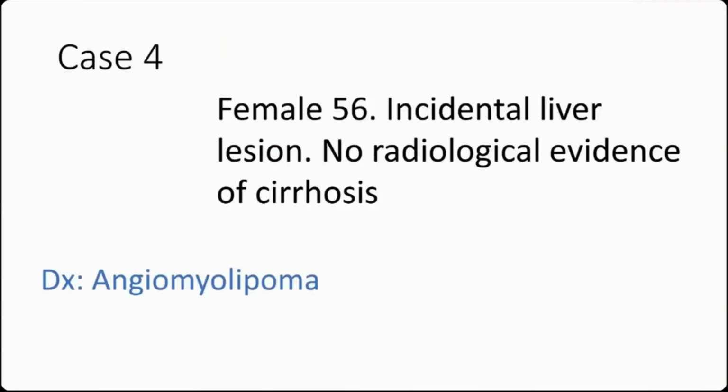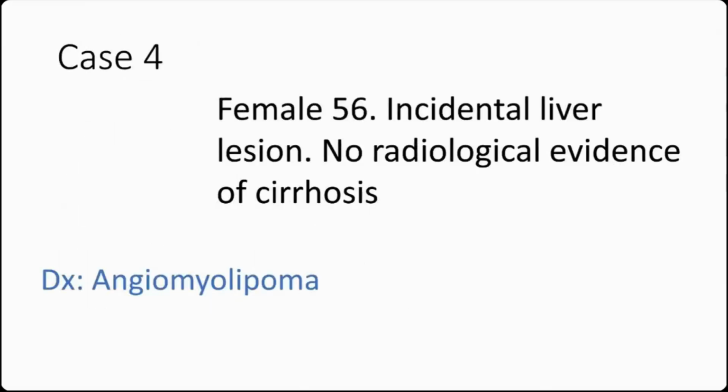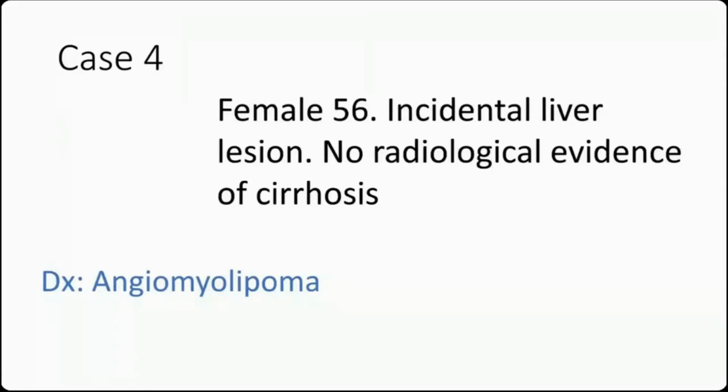Now, I find these extremely scary. It's not unusual for us to diagnose hepatocellular carcinomas on non-cirrhotic livers. It happens. But angiomyolipomas can mimic hepatocellular carcinoma, and you need to be thinking about them.